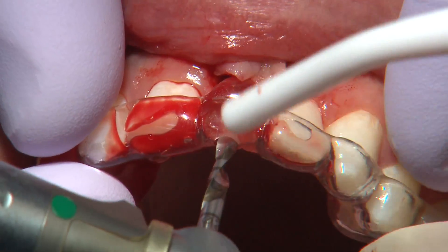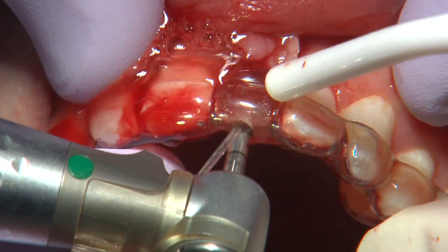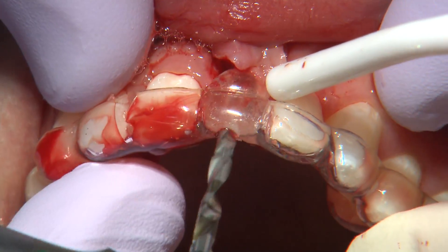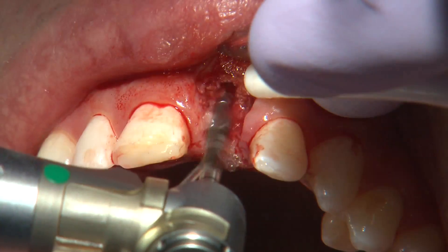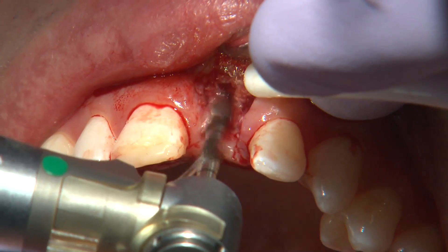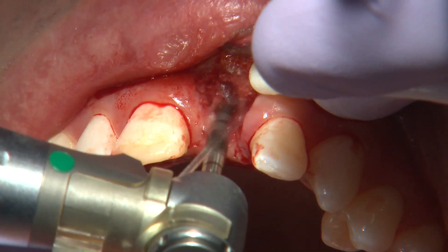I go ahead and complete the osteotomy, going through the steps to widen it in this situation, and when the osteotomy is completed and prepared, I can go ahead and place my implant.